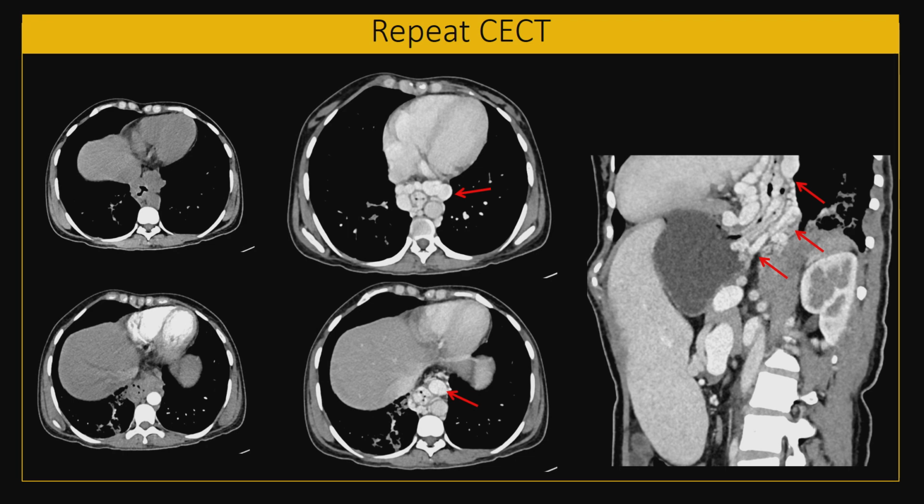Previously, even though contrast enhanced CT was done, the protocol was not right. It was not a venous phase, it was an arterial phase. So not even a single one of the collaterals was enhancing. So it was mimicking a mass, which in practicality, as you can see in the sagittal images, all the possible columns of esophageal varices that you can see in a case, all 4 or 5 columns are seen in this case. And the right lower lobe sequestration, that diagnosis was correct.